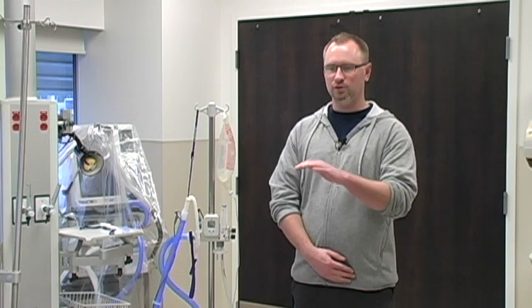The big thing when we're thinking about escalating up the oxygen therapy levels is, as we move towards that high flow aerosol device, we're trying to give the patient high concentrations of FiO2. The problem is that we're not meeting their inspiratory flow demands. So what's happening is the oxygen that we're delivering to them is being diluted by the room air that they suck in, that they need to meet their inspiratory demand. So the Optiflow will actually give enough flow of 100% oxygen, if it's what we need, to meet the inspiratory demand, so it's not being diluted by the room air. So we can actually give a patient a true 100% oxygen, as opposed to we top out typically around 80% on our previous oxygen therapy devices.